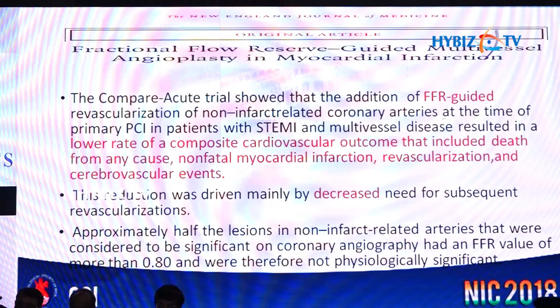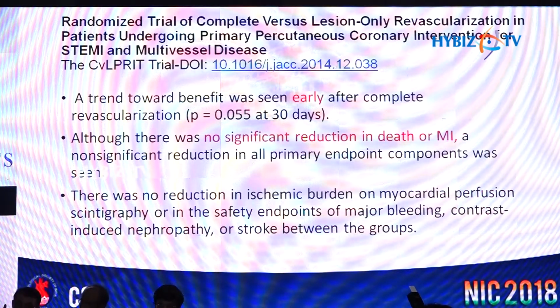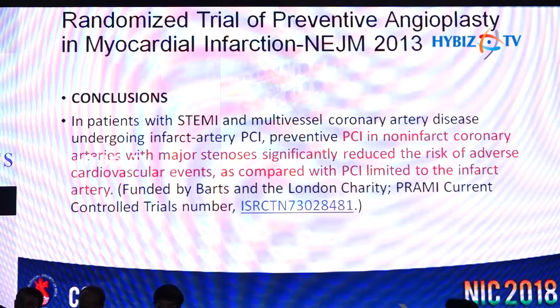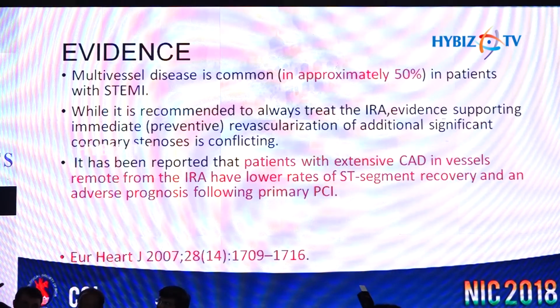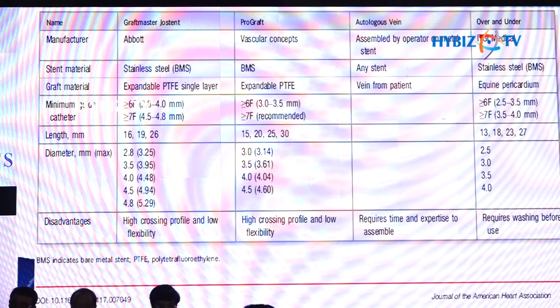That actually caused oversizing of the stent. The size was 2.75, which is not large, but probably it went to a higher pressure unintentionally. The stent size in this picture looks like 3 millimeter now. 11 atmospheres, 10 atmospheres, 11 atmospheres. I am just telling you this could have been one reason. Otherwise, oversizing is the main reason.